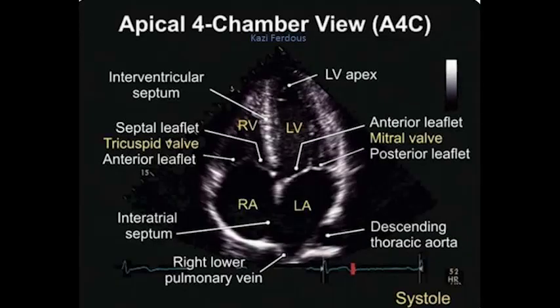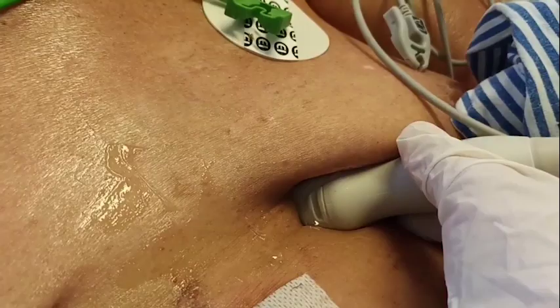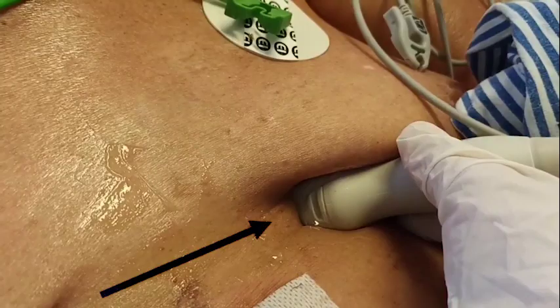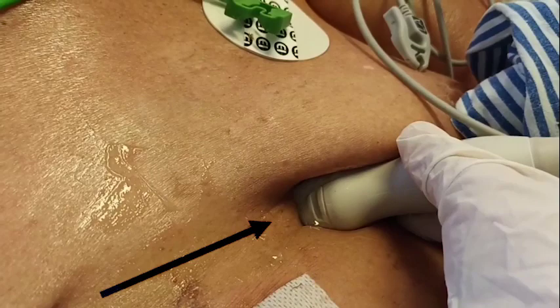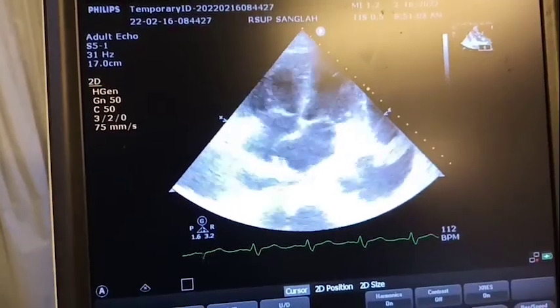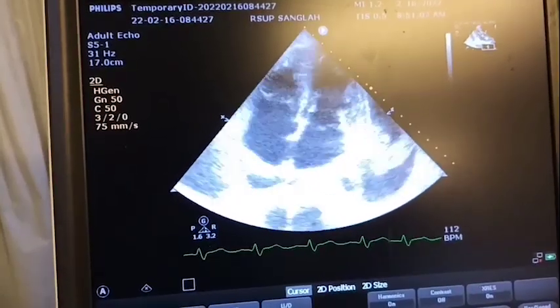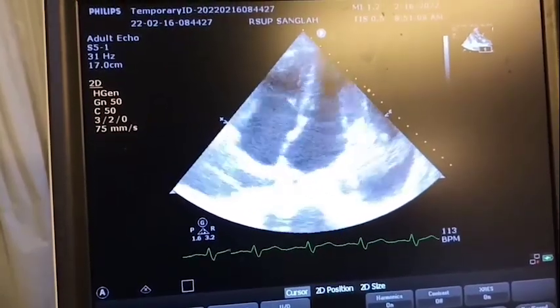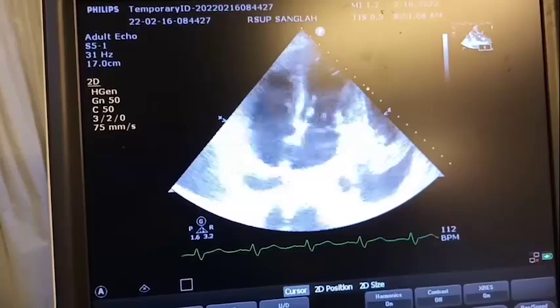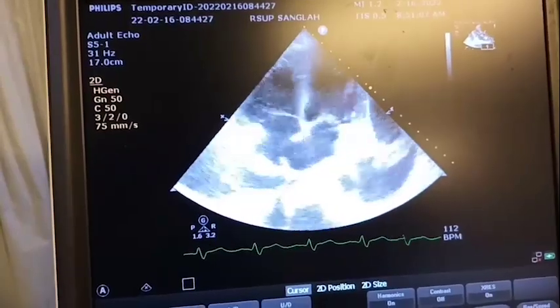Step 2: Approach the apical four-chamber view. The probe is placed in the fifth to sixth left intercostal space. For the four-chamber view, the marker is pointed at 3 o'clock.